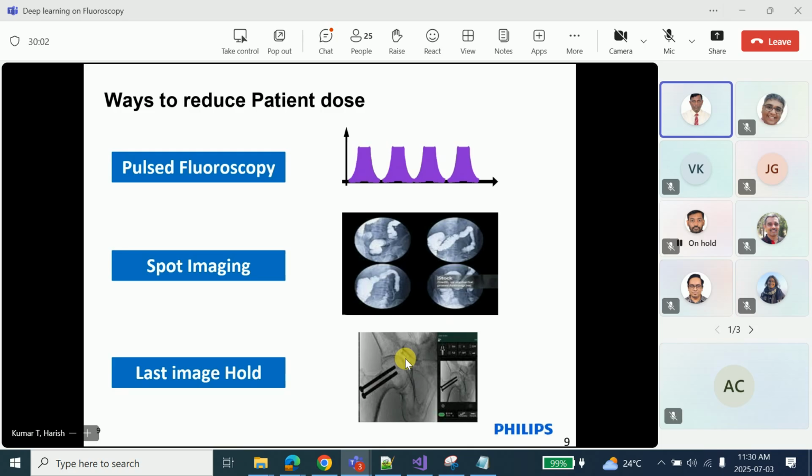That is mainly important for fluoro. Fluoro is not concentrated on one part. It's concentrated on systems like the blood system or heart system, or digestive system, as you told, urinary system.